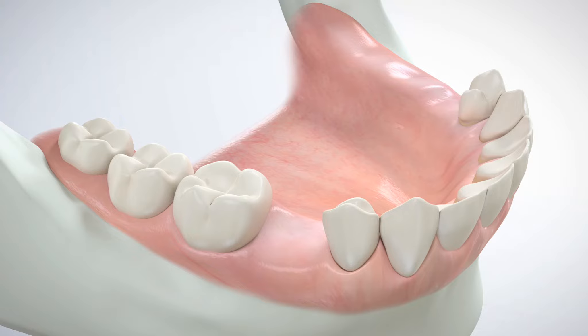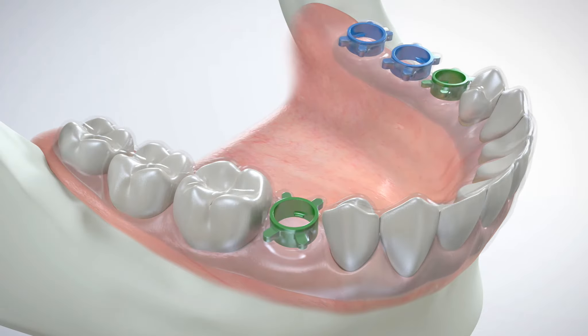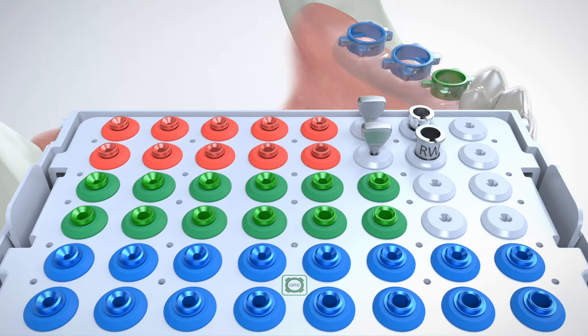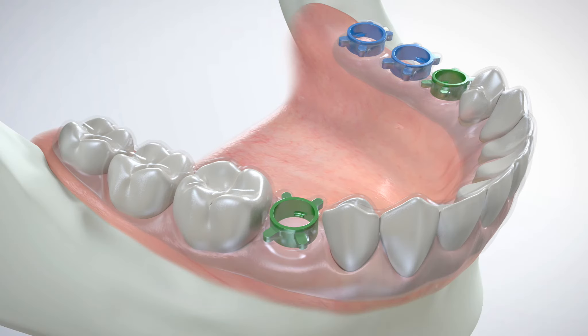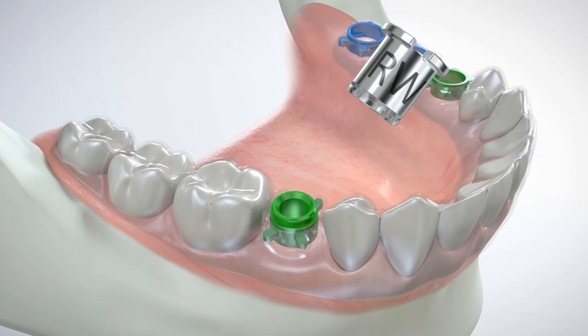Simply place the GRS surgical guide onto the teeth. Remove a GRS drill sleeve matching the diameter of the tissue punch from the surgical cassette using a GRS IR tool. The drill sleeve is then snapped into the surgical guide, and the IR tool simply separates from the drill sleeve using a sliding motion.